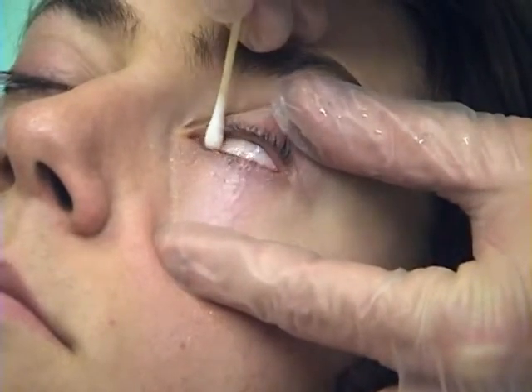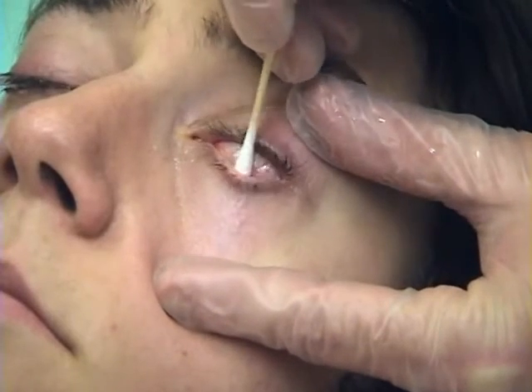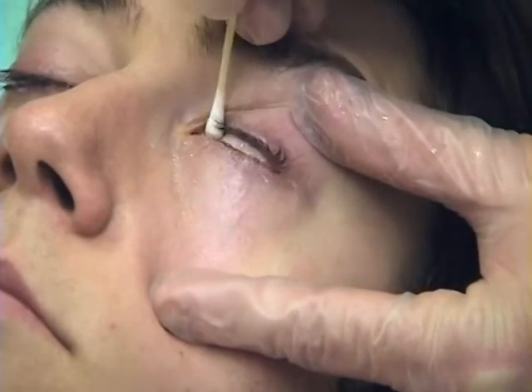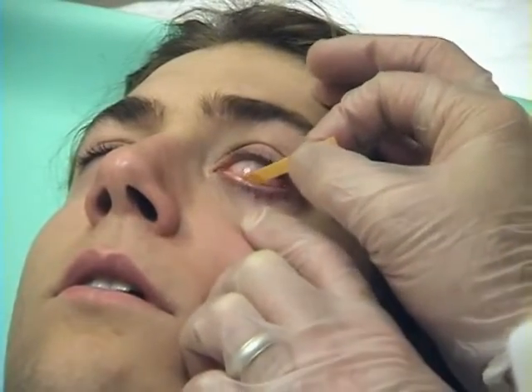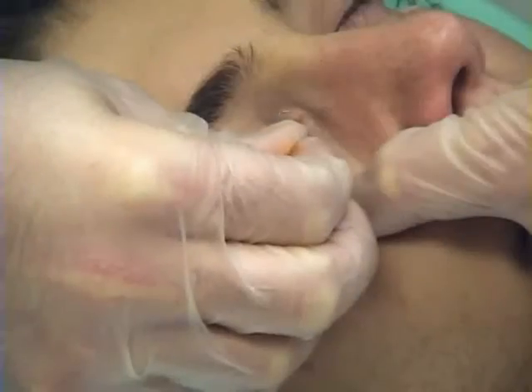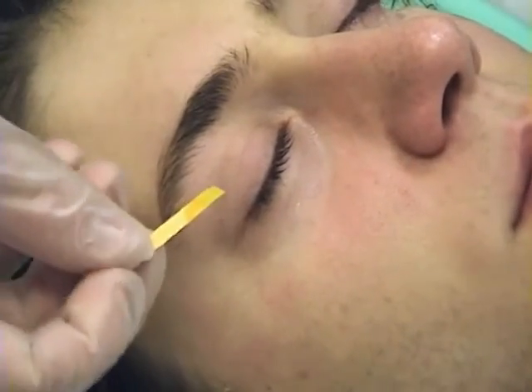Resweep both the inferior and superior fornices to remove any residual particles that cannot be visualized. Check the pH of the eyes again after irrigation. If a neutral pH of 7.0 has not been achieved, continue the irrigation.